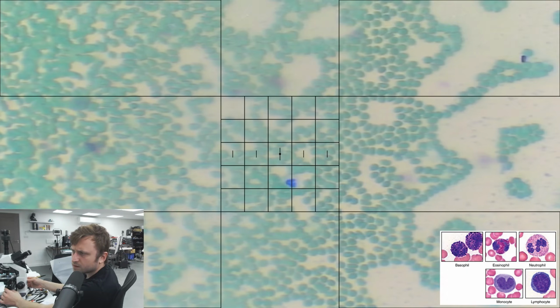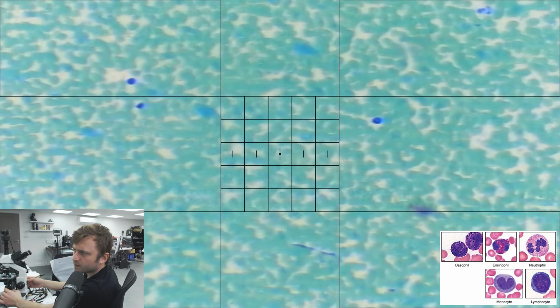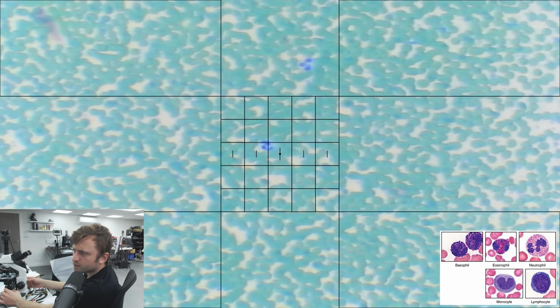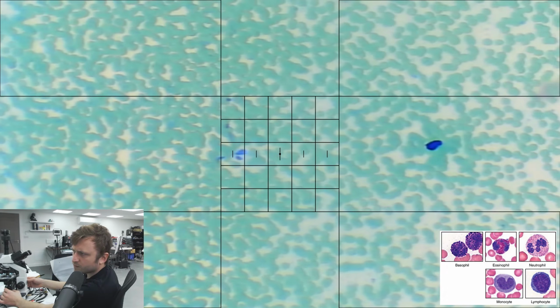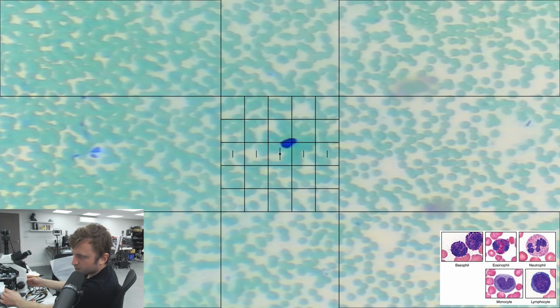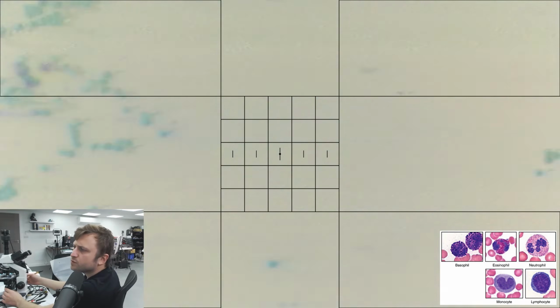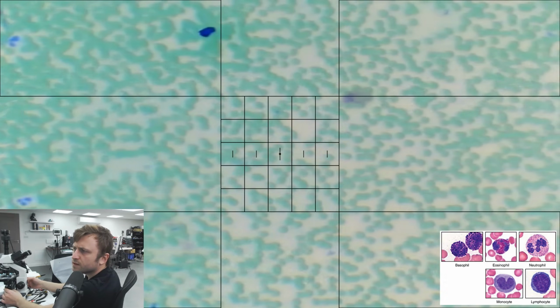Neutrophil. Neutrophil. Going down row. Scanning. Lymphocyte. Neutrophil. That's lymphocyte, neutrophil. No. Lymphocyte, neutrophil, unknown. Gonna go unknown for that blob. I believe that's more debris. Reach the end of that row. Go down and proceed left.